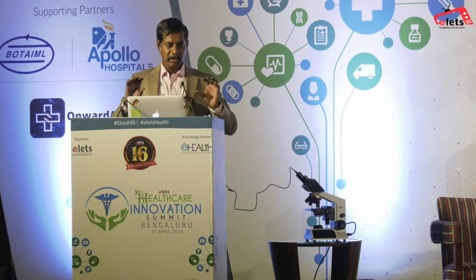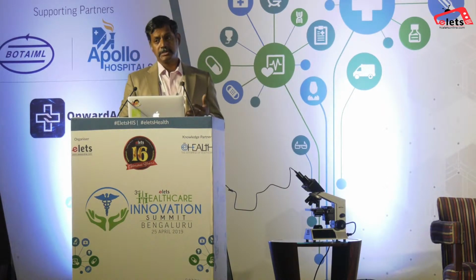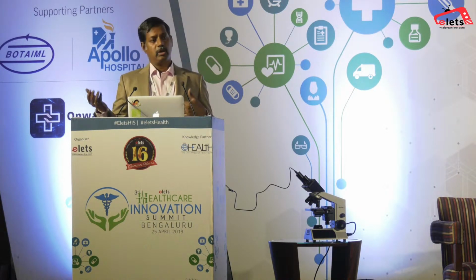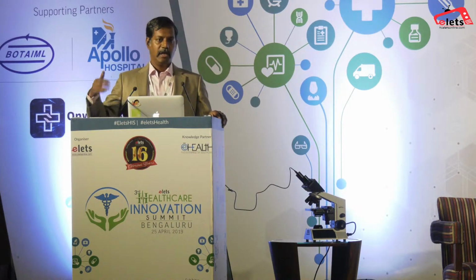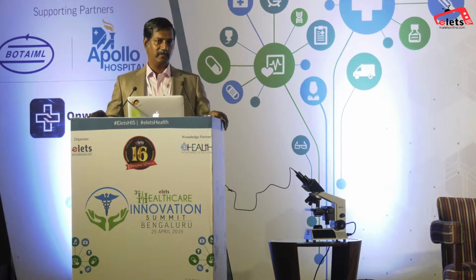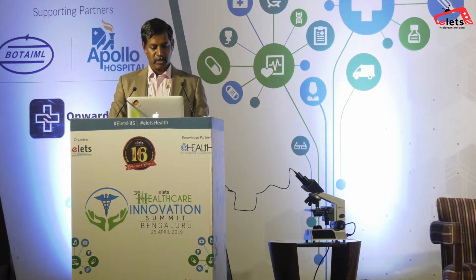So we mimicked the workflow exactly to match that, so that there are no additional steps, because that either introduces additional steps or a lag in the reporting process, or, in terms of the clinician using the platform, it affects adoption and their ability to appreciate the benefits of using the technology. So that was primarily our focus.